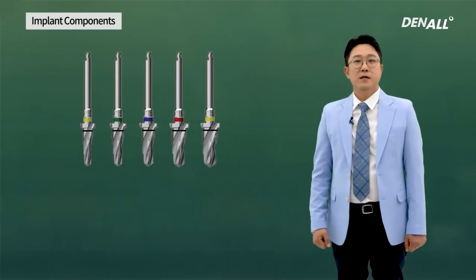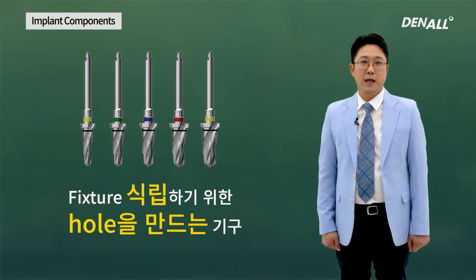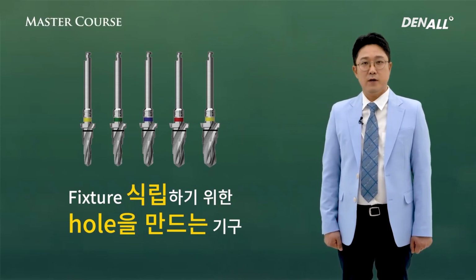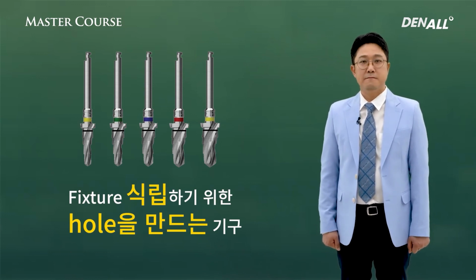Surgical drill is a machine to drill a hole on the bone for implant placement. Various drill is used to create holes safely, and regarding the usage of drills, this will be addressed in detail during lecture on surgical kit.